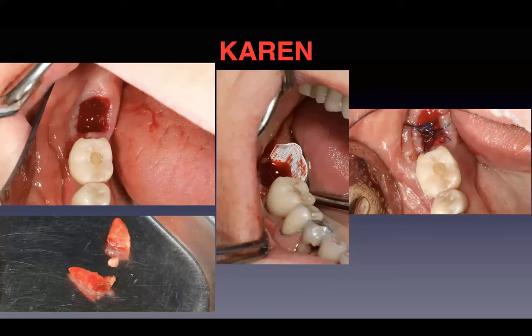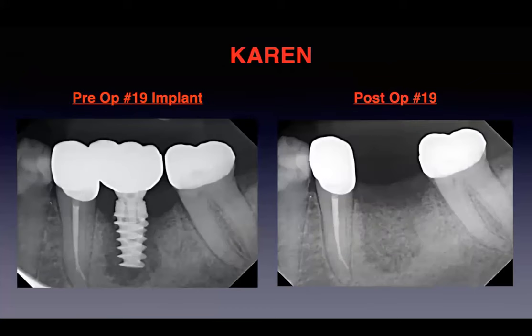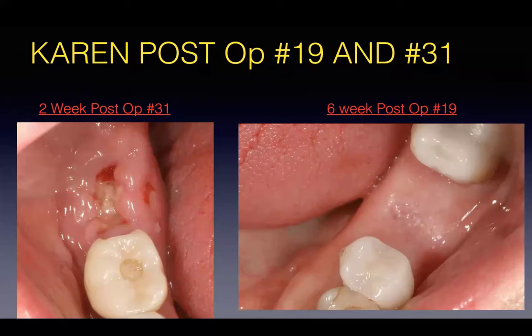So this was her pre-op of 31 and then her post-op. Same thing with 19. So I saw her for her 2 week post-op of 31. And then to the right, you've got this now 6 week post-op of 19. So that's all healing well, as expected.